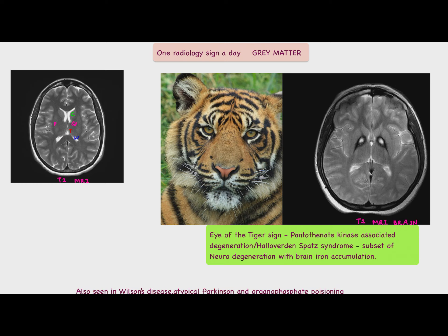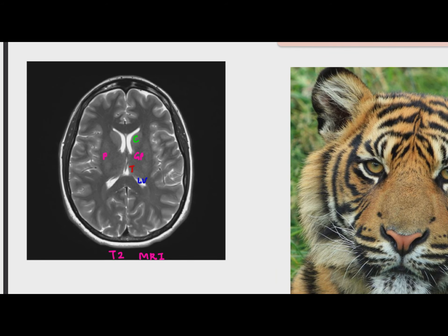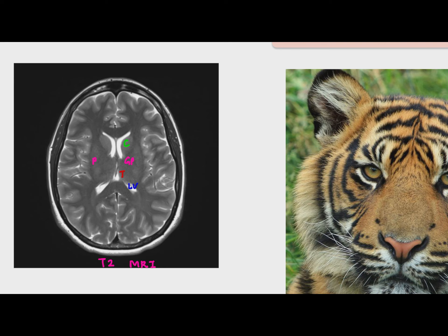Before we go to the sign, let's look at the basics of this brain MRI section. This is a T2-weighted MRI image. In T2, the white matter is dark, the gray matter is light, and the CSF appears bright. The structures labeled here include the lateral ventricle with its frontal horn and occipital horn, the caudate nucleus, the globus pallidus, the putamen lateral to that, and lower down, the thalamus.